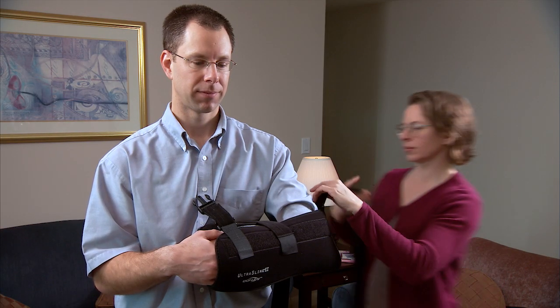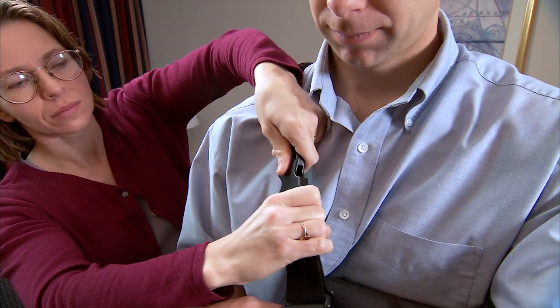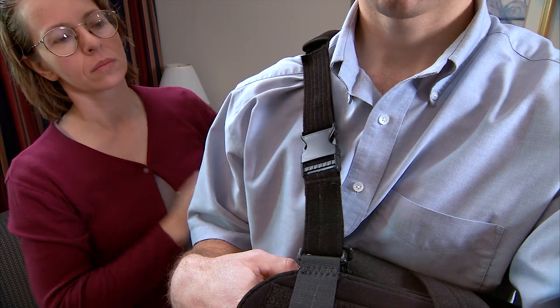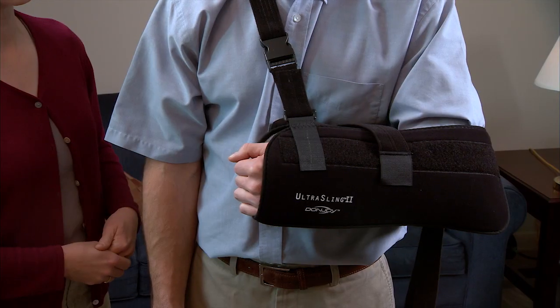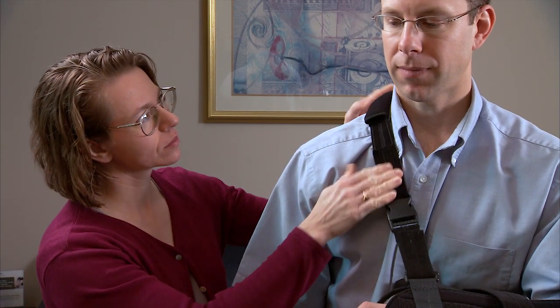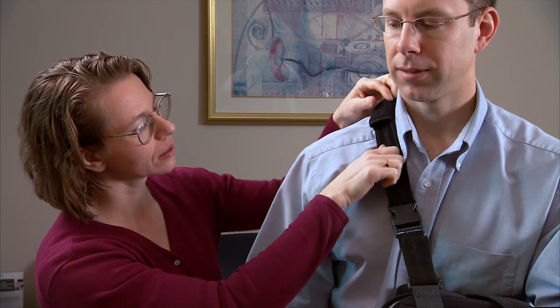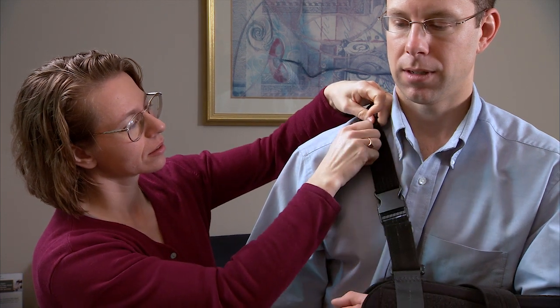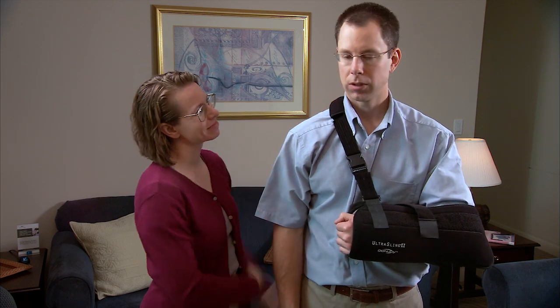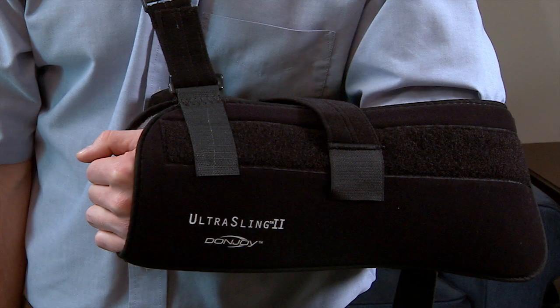Your helper puts the shoulder strap around your neck and fastens the strap to the clasp on the sling, then adjusts the strap to support your arm in the proper position and fastens it with Velcro. The strap needs to be tight across the back of your neck to support your shoulder. It's a common mistake to have the strap too loose. That may feel more comfortable, but it doesn't support your shoulder properly.